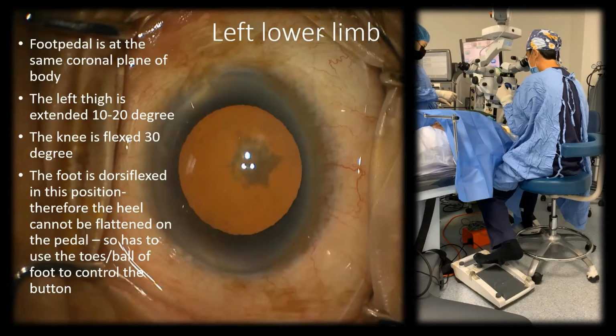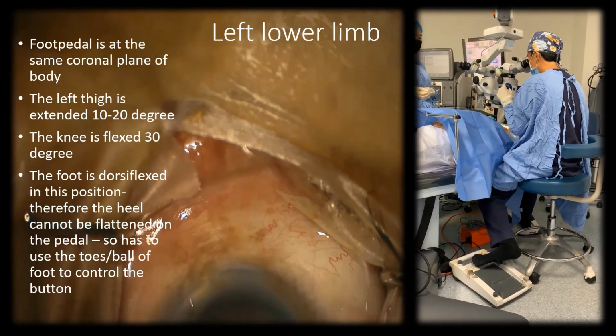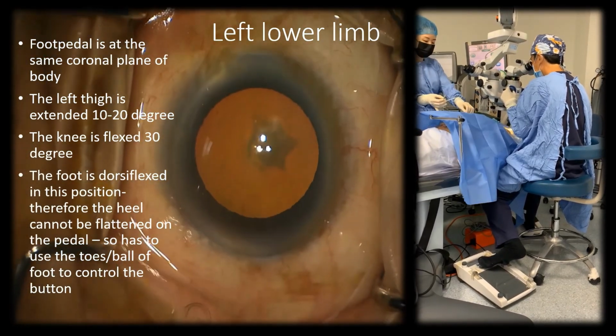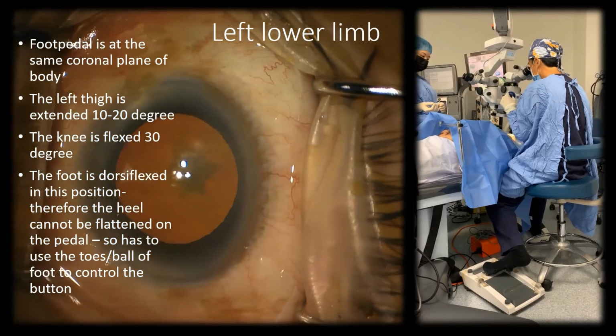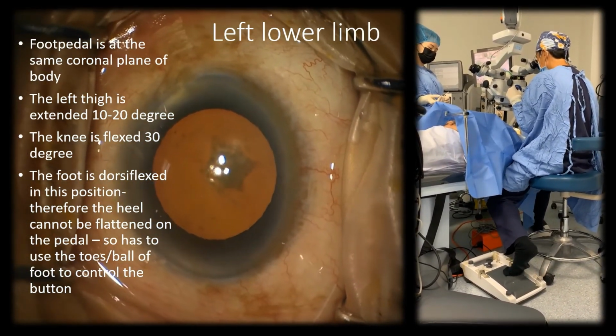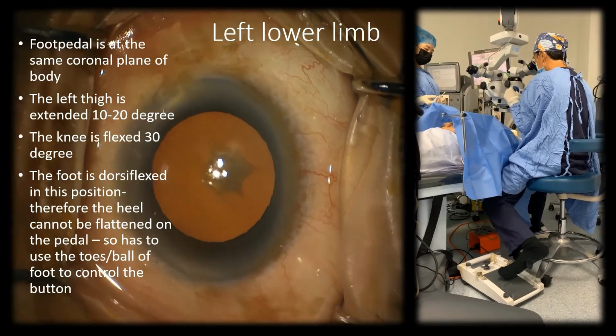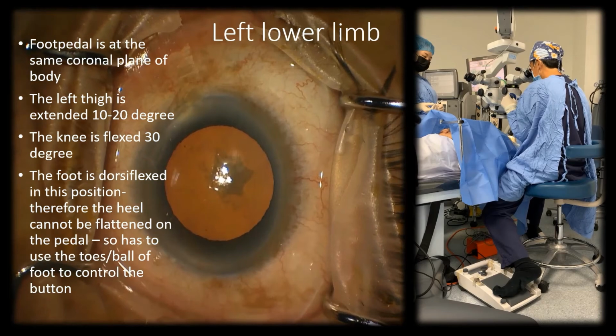The foot pedal is placed at the same coronal plane as the body. The left thigh is extended 10 to 20 degrees and the knee is flexed about 30 degrees. In this position, the foot is dorsiflexed. Therefore, the heel cannot be flattened on the pedal, so one has to use the toes or the ball of the foot to control the button, as I am showing now.